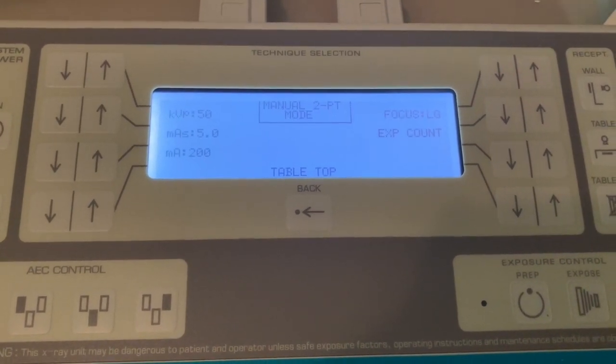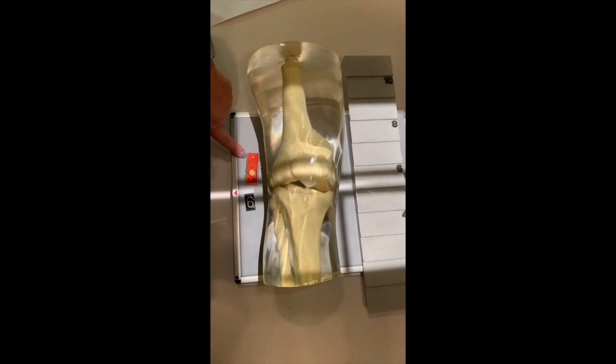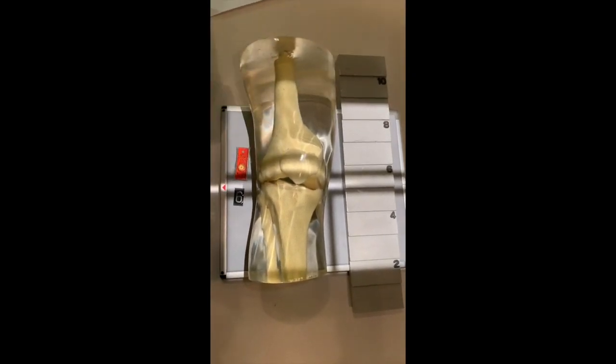So now we're gonna set up the actual knee and the step wedge. You need to set up 10 by 12 crosswise. A knee is gonna be on half of it, and the step wedge is on the other half. You're gonna center just below 6 on the step wedge. You're gonna include your marker on the right-hand side, lateral side, and a number. I'm not gonna change the number just so we can get through this, and you open it up to 10 by 12 all the way.